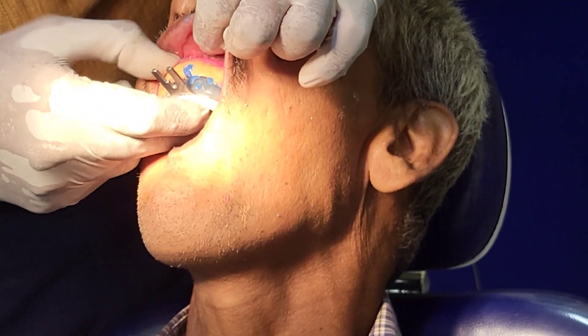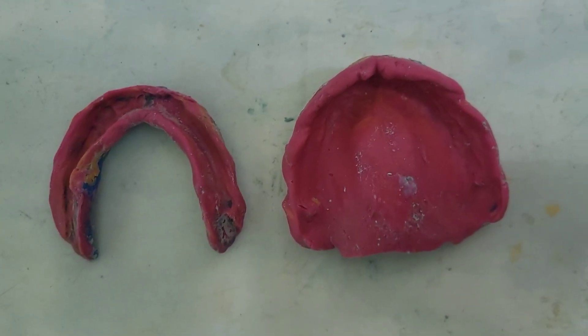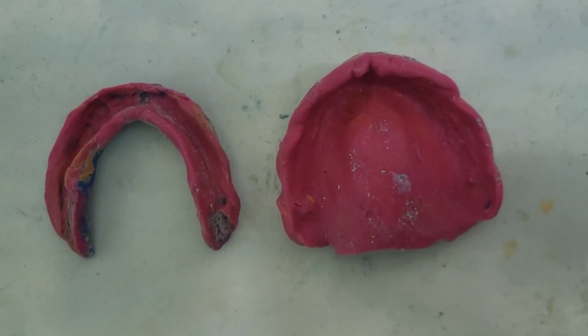Once the material has set, we can remove the impression. We have now completed the border molding procedure. You can see the border molding of the maxilla and mandible done with putty and light body.